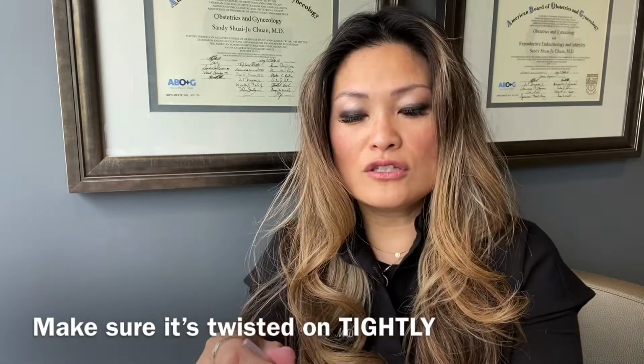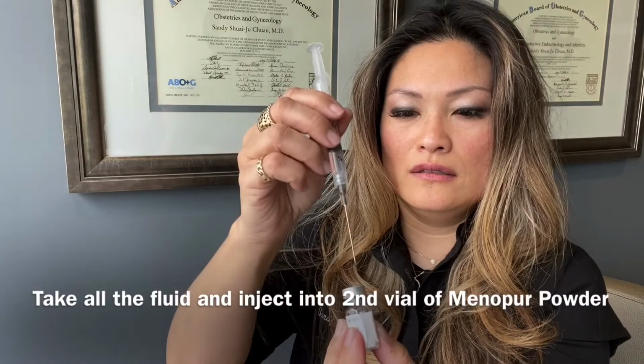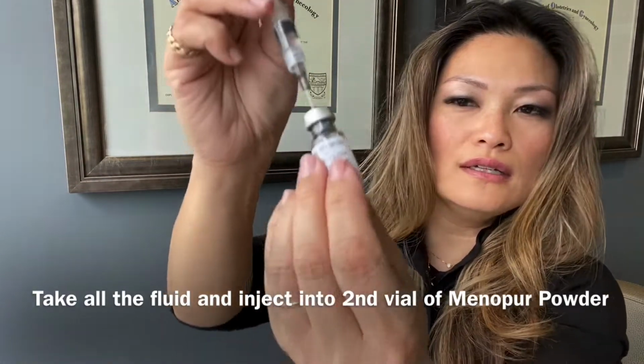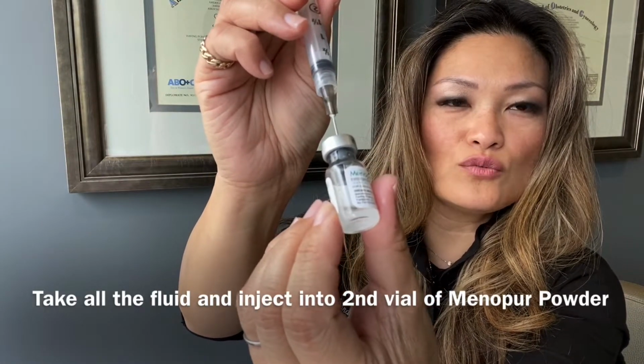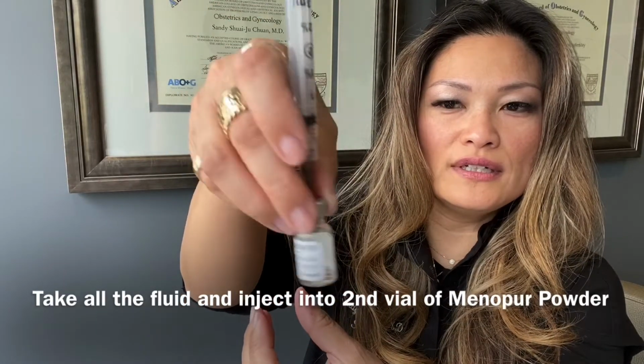However, let's just assume that you are someone who needs 2 vials of the powder because you need 150 units. So then you would just keep this needle on. Now this already has the fluid from the first vial you mix. So then you would just take your second vial, and I'm going to show you here, second vial of powder. Put that in, and it just dissolves really quickly. I wish I could have showed you exactly how fast. And you just want to push the whole thing in, and then again you could gently swirl it.